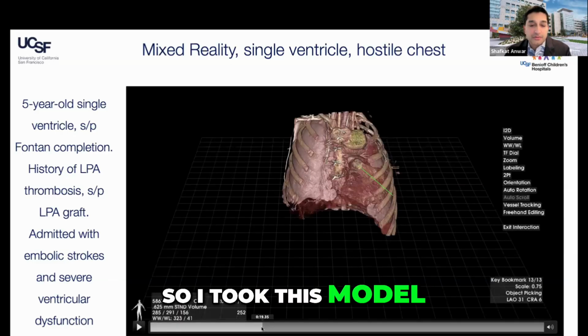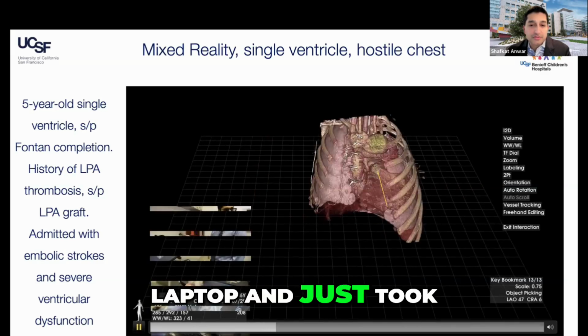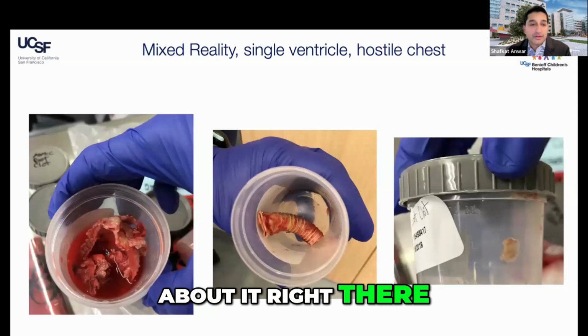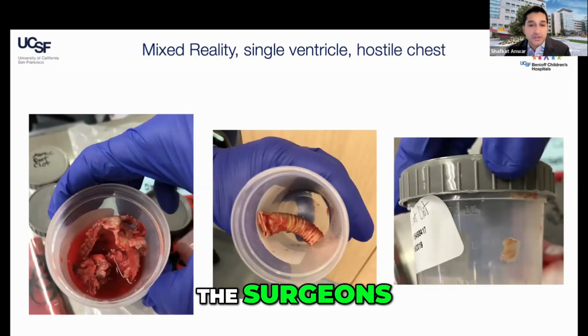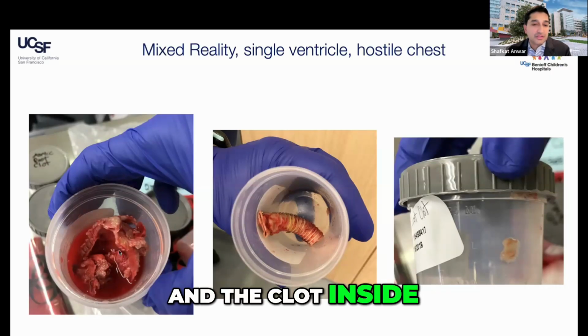So I took this model, this plan, I put the video on my laptop and just took the laptop to the OR and just talked about it right there. And after a pretty quick planning session with the surgeons, this is what they found. This is the pseudoaneurysm and the clot inside it that they resected.